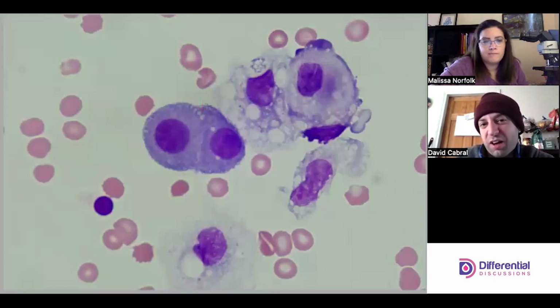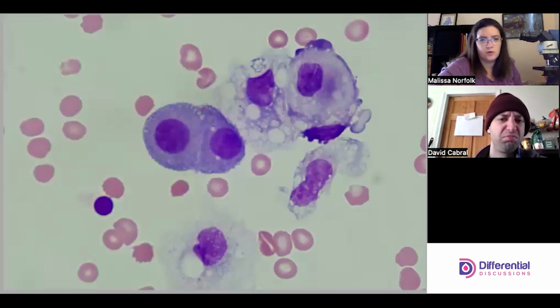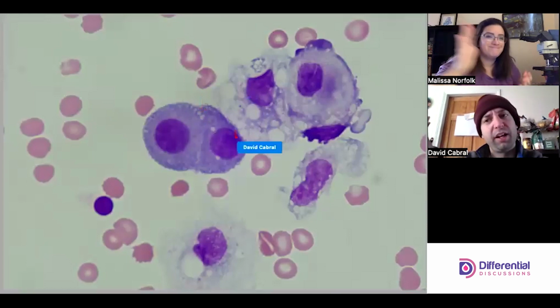I'm not offended to call these mesos. I'm not either. I was debating in my head, but I was looking and I'm not seeing the deep dark variations in the coloration either in the cytoplasm or in the nucleus. Yeah, because I'm trying to be mindful, because over here it's a little dark, but it's also being kind of smushed.